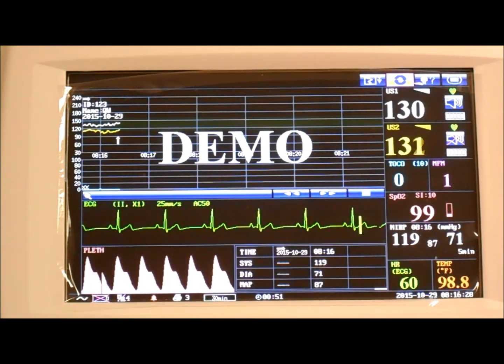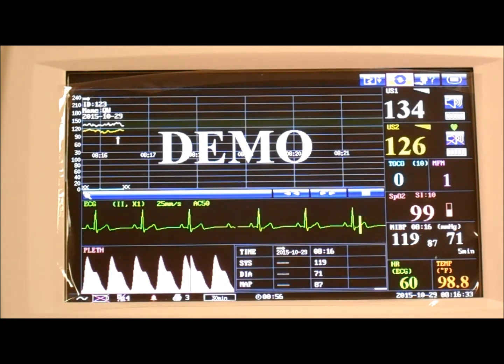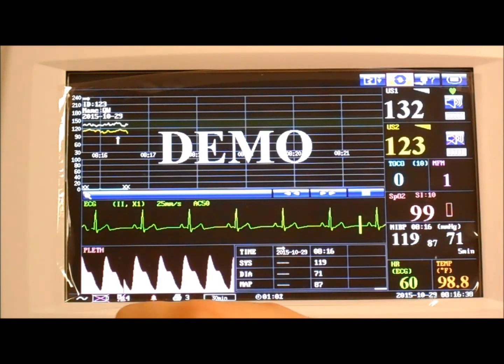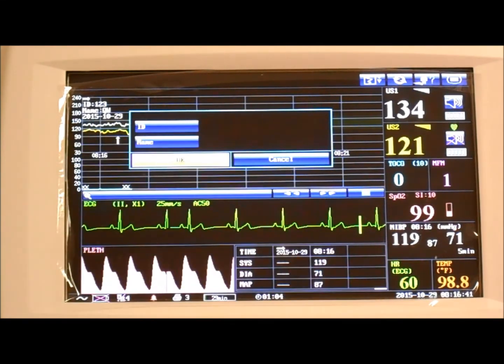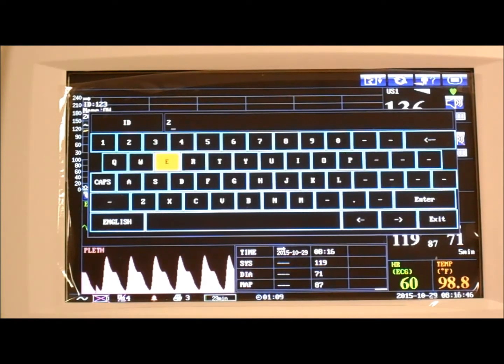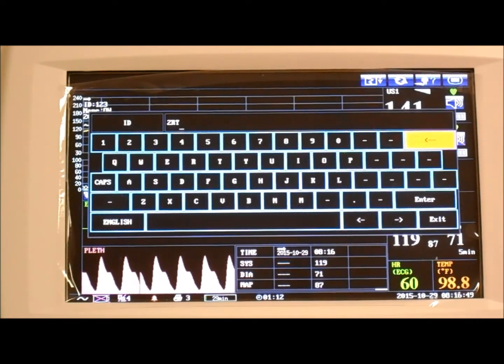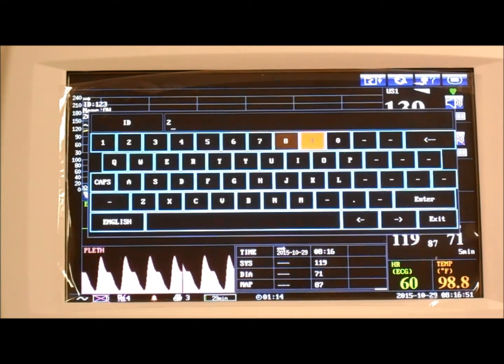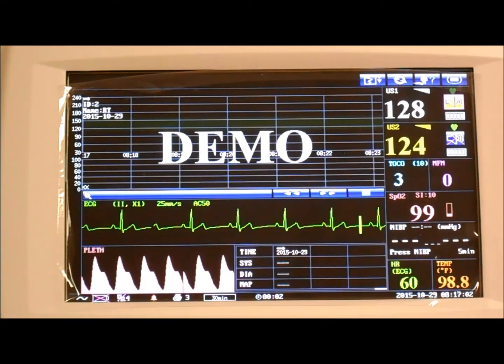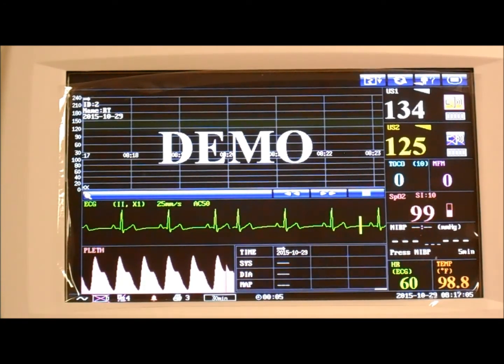So it's that simple. You place all the transducers on your patient. The monitor automatically starts recording information, and when you press start, it clears the previous patient and you start a new patient. So now we go to ID 2 and the name is RT. Oh, sorry. 2. Enter, and the name is RT. So it's press OK and it clears. You start a new patient. So there's new patient information.